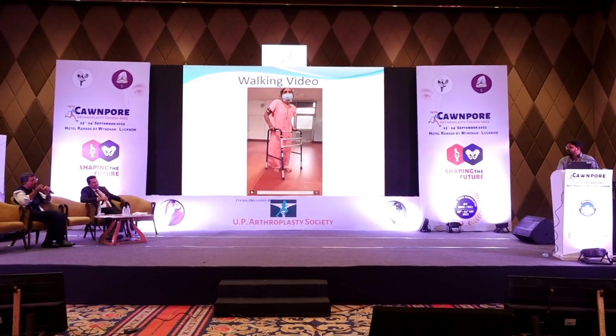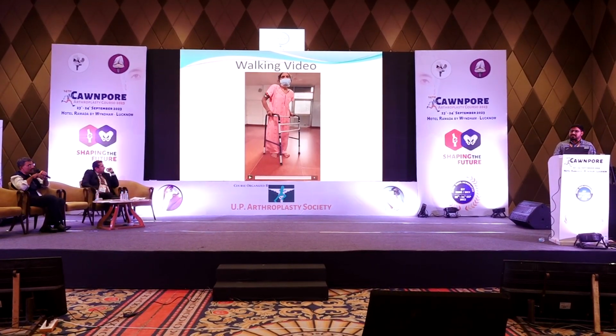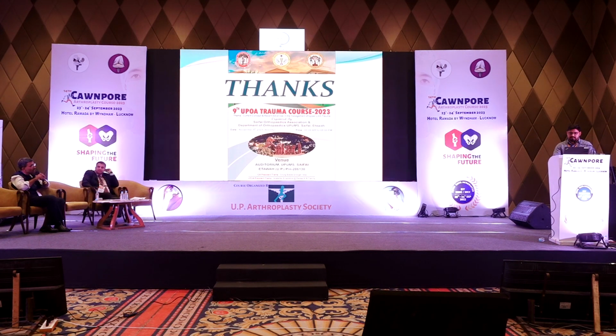So you got a very good fixation. What size did you ream till and what is the size of the stem you put in? You said 10, 14? Yes, sir. What is the diameter? 14. Length, okay. Did you ream till the same size or did you ream a little more? Sir, same size. How old is the patient? 65 years, sir. Very good. Thank you, sir.